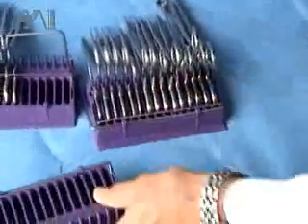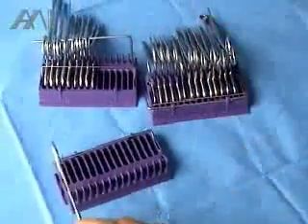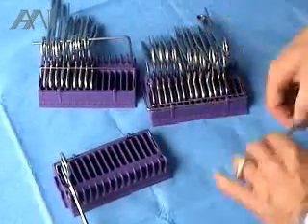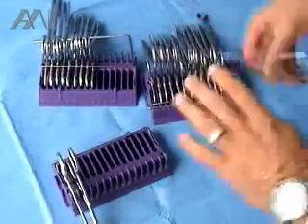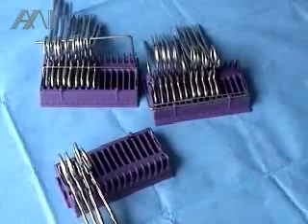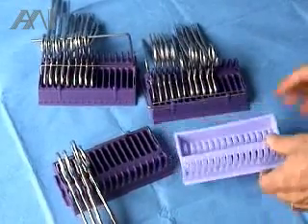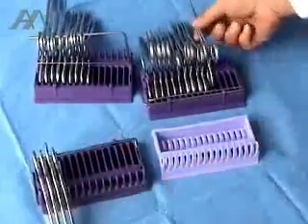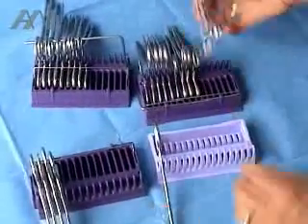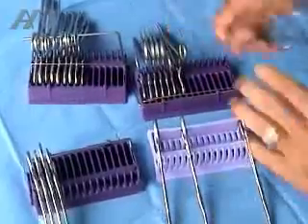You can have another empty one on the Mayo back table, and you can move the instruments into a reusable system, as it is done here, or a disposable instrument organizer that can take all the instruments on the Mayo from the back table.